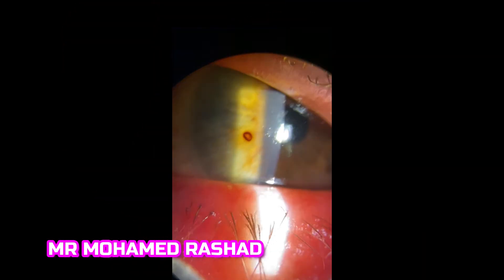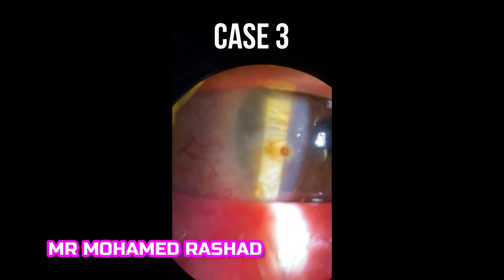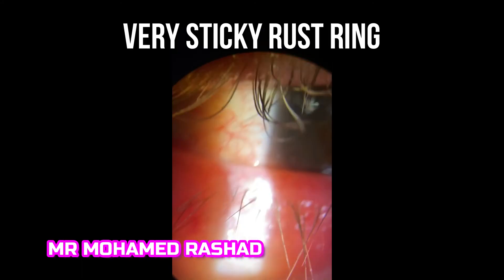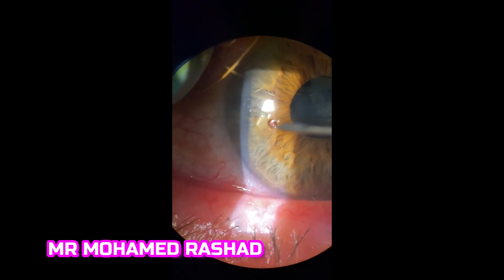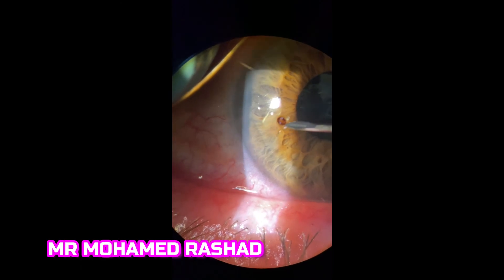This is a third case involving a very sticky rust ring. The metallic foreign body itself is not found, as there were a lot of previous attempts to remove it. We can try to remove this rust ring.